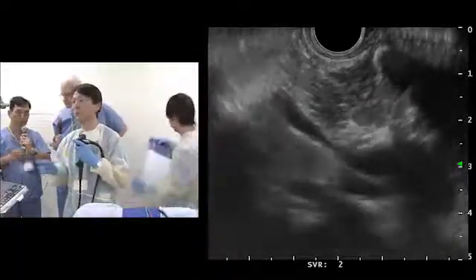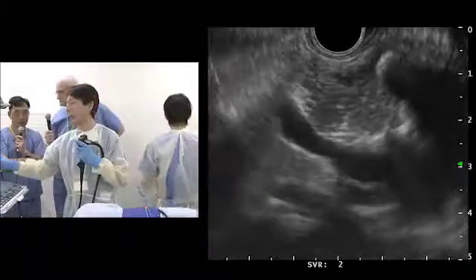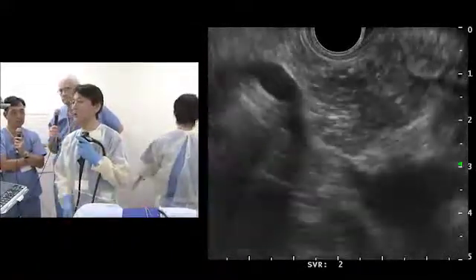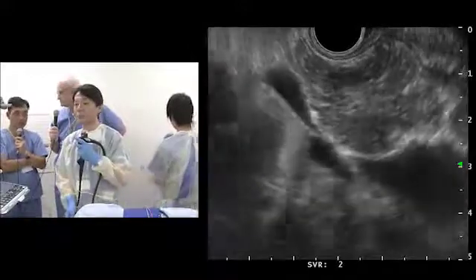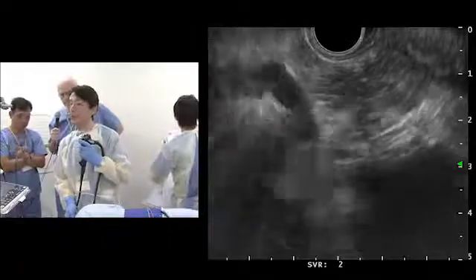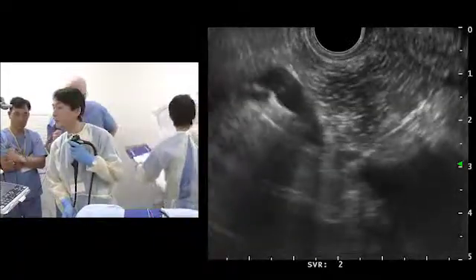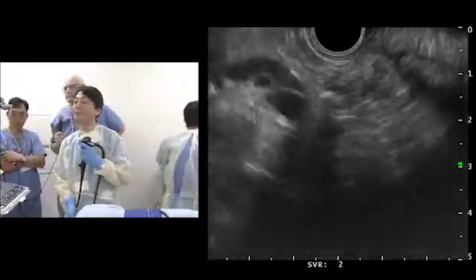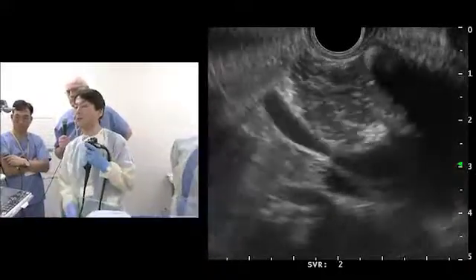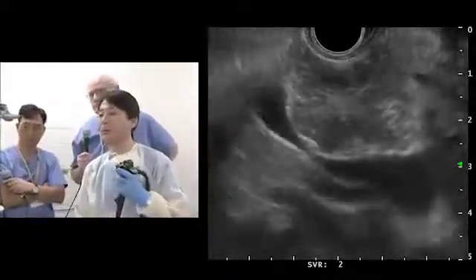Well, I heard that the 19 gauge nitinol based needle is much more flexible, so I think the movability is not good because of the long position. Yes, I agree. Professor Ryozawa, what would be the differential diagnosis from this finding?